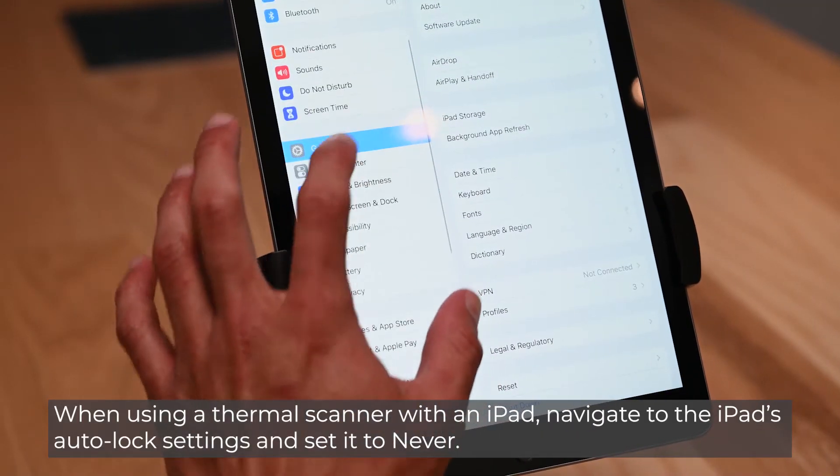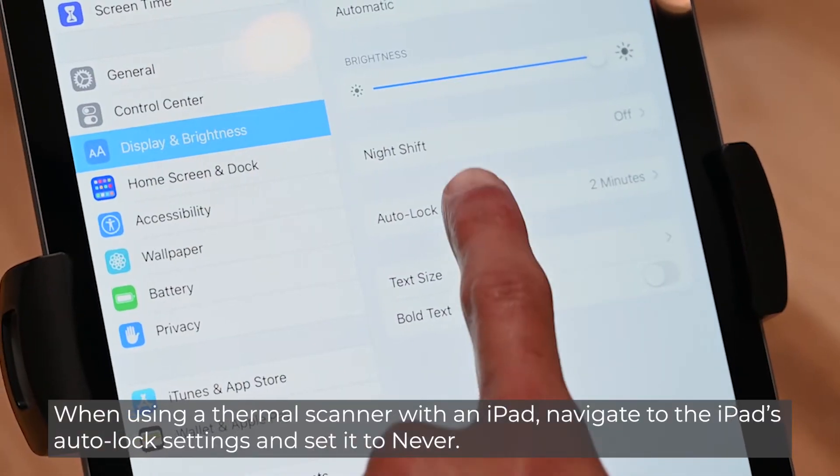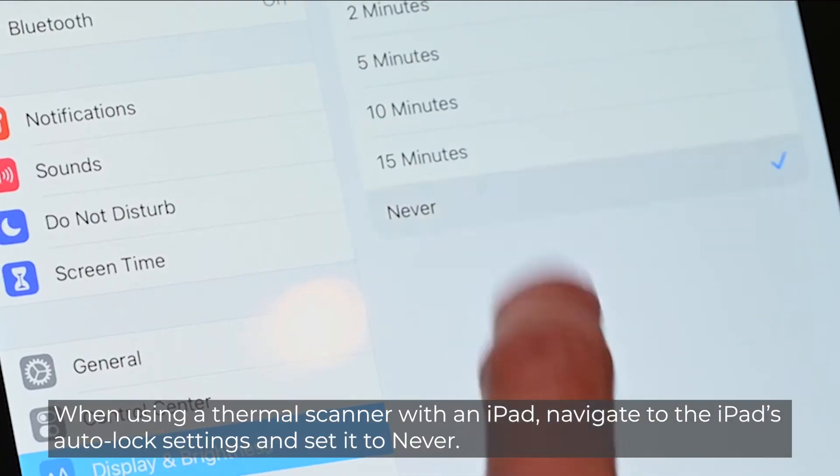When using a thermal scanner with an iPad, navigate to the iPad's auto lock settings and set it to Never.